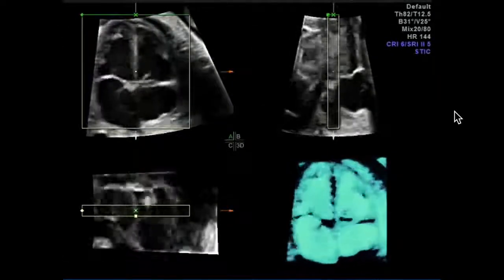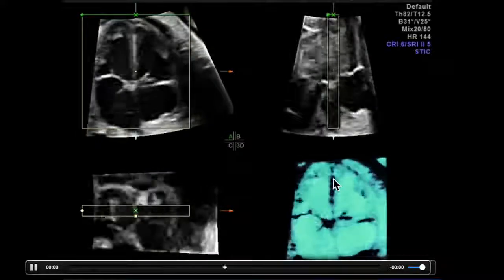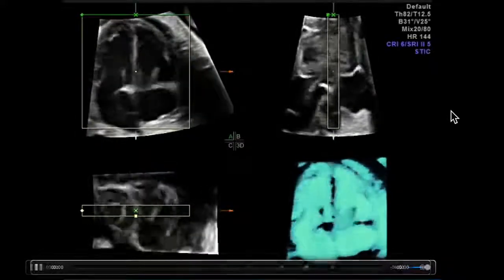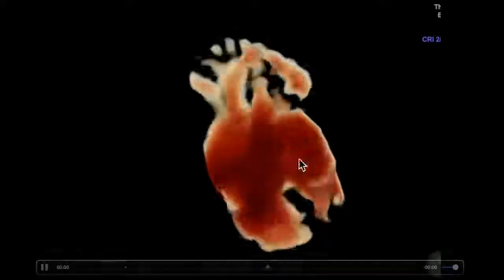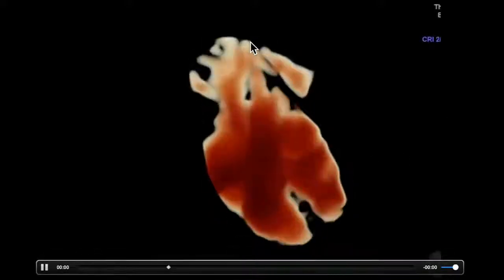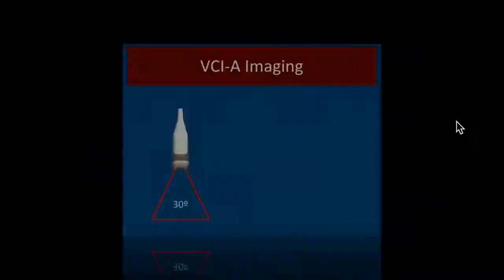Inversion mode is also really good to look at integrity of the ventricular septum, because you're able to see defects more clearly as something that definitely crosses as opposed to the absence of something. And finally, here's an inversion mode of a whole first trimester heart, where you can really see crossing of the outflow tracts, the aorta coming back towards the left in the 3-vessel view, and the head and neck vessels.